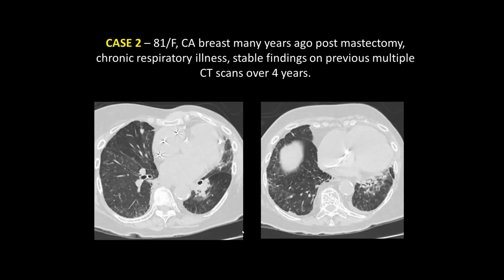These are all indolent, and they take a very long time to grow. That is why the follow up is sometimes over 4 to 5 years. They follow up the patients, and the whole point in following up is if it's just pure ground glass, no issues. The development of a solid nodule warrants further evaluation. That is why we follow up all these ground glass nodules.